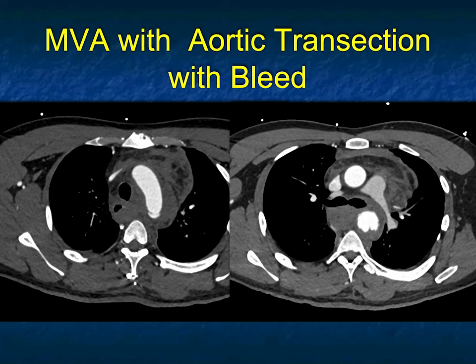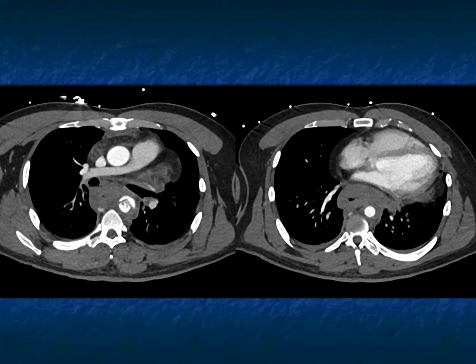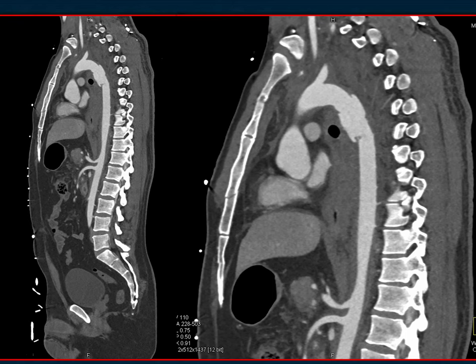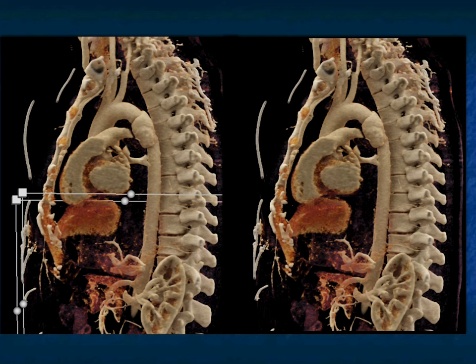This was an MVA with aortic transection. On additional images, there's a big posterior mediastinal hematoma, differential flow in the components of the aorta, and blood tracking along the esophagus. The sagittal view nicely shows the laceration, the tear, and the extensive blood in the aorta — typical location at the ductus region. This patient was lucky to make it to the hospital and was successfully repaired with a stent. A detailed article on this topic is available in Emergency Radiology and on the CTSS cinematic rendering series.